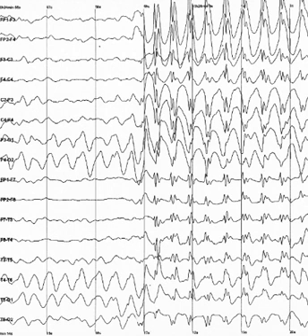The electric potential generated by an individual neuron is far too small to be picked up by EEG or MEG. EEG activity therefore always reflects the summation of the synchronous activity of thousands or millions of neurons that have similar spatial orientation. If the cells do not have similar spatial orientation, their ions do not line up and create waves to be detected. Pyramidal neurons of the cortex are thought to produce the most EEG signal because they are well aligned and fire together. Because voltage field gradients fall off with the square of distance, activity from deep sources is more difficult to detect than currents near the skull.